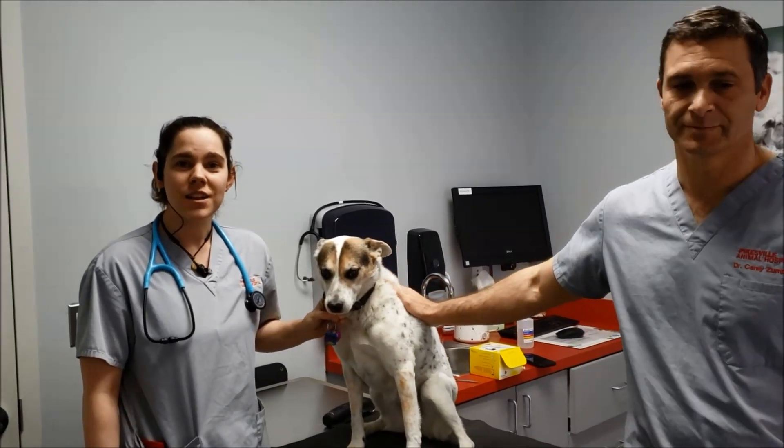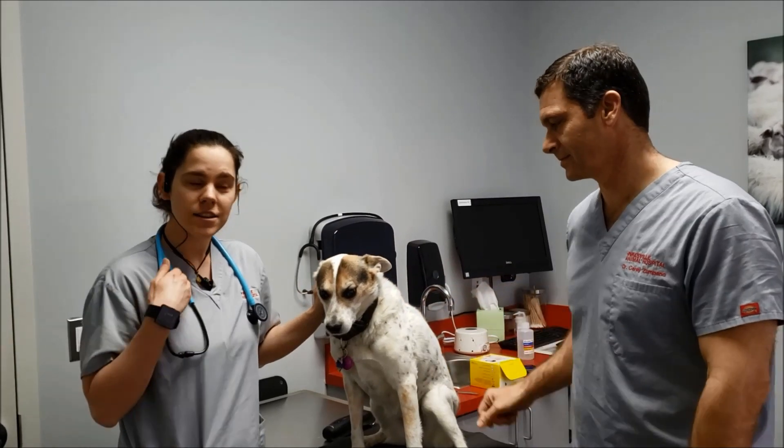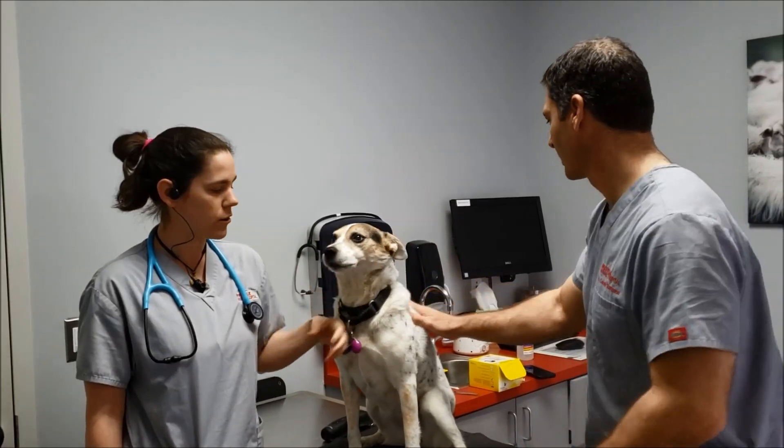Hi, welcome to Pikesville Animal Hospital's Client Education Video Series. Today we have Bandit and Allison and Dr. Zampano, and we're going to talk about Freestyle Libre insulin and glucose monitoring.